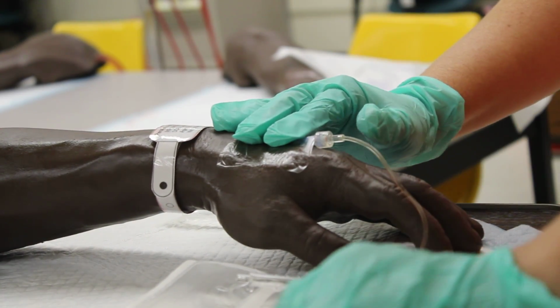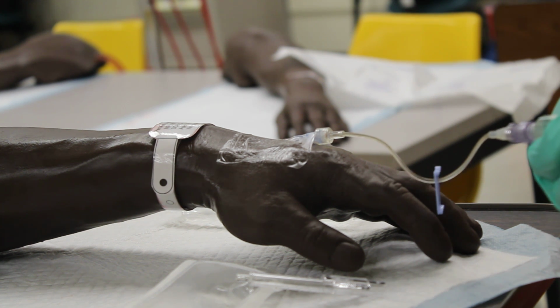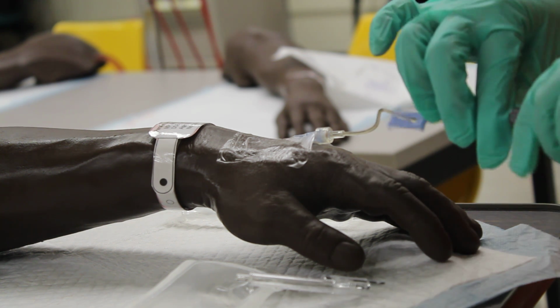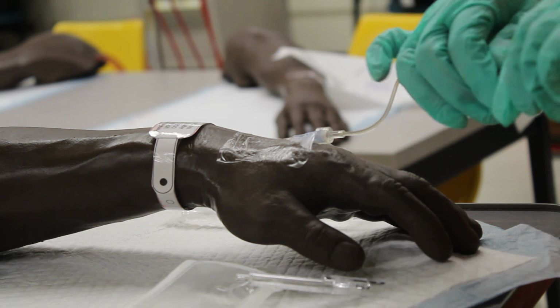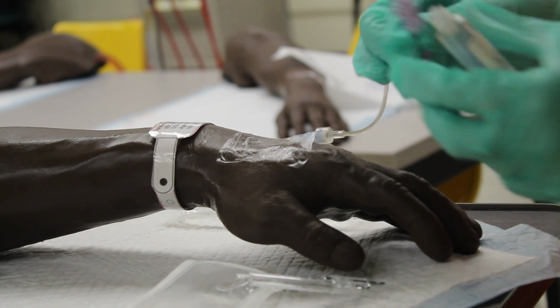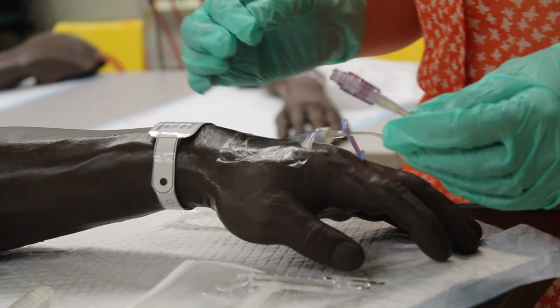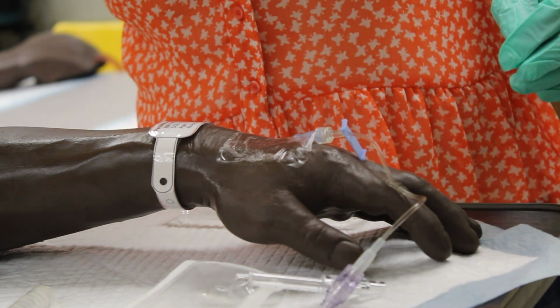So at that point, once it's in there, I'm going to pull back and see if I get blood return, and then I want to actually insert 2 to 3 cc's of saline. When that goes through, then I can actually remove the extension from my saline, and at that point I won't need that anymore. Now I need to stabilize my IV.